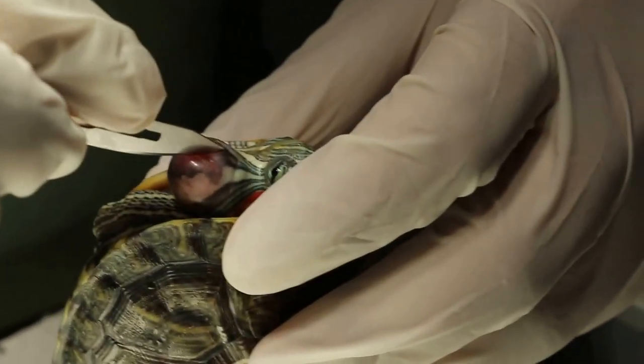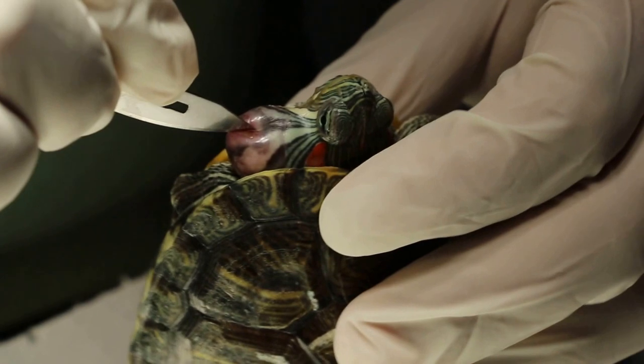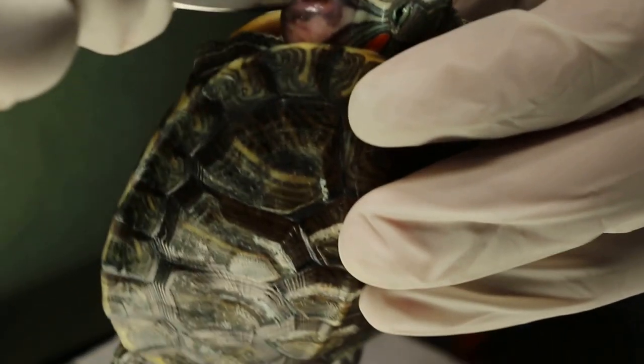We will take it out, and then cut along the lower part — the ventral side — with a scalpel blade. Cut along the lower part, the reddish part. Make a long cut, about one centimeter, not a small one — a long one here.